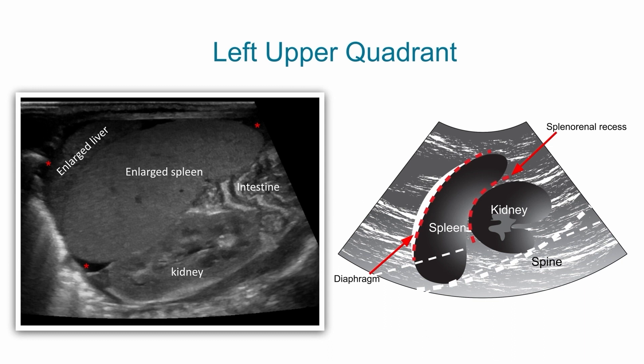In this image here, we see an abnormal left upper quadrant because we see ascites fluid marked by the red star. We see an enlarged spleen, the intestine, and the large liver.